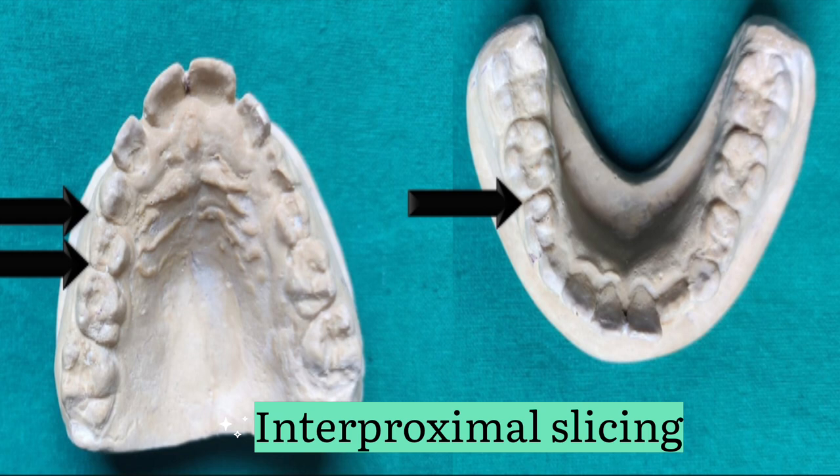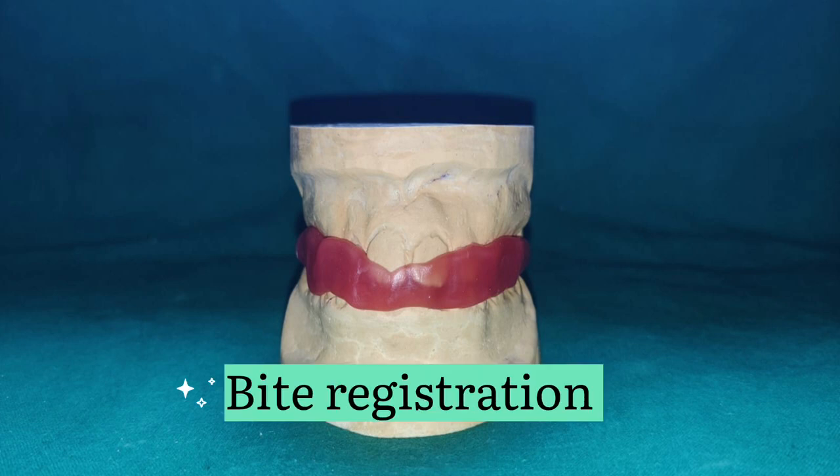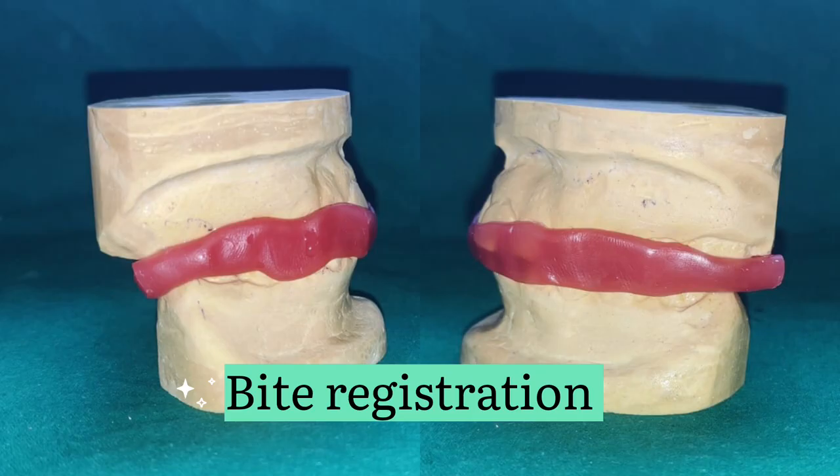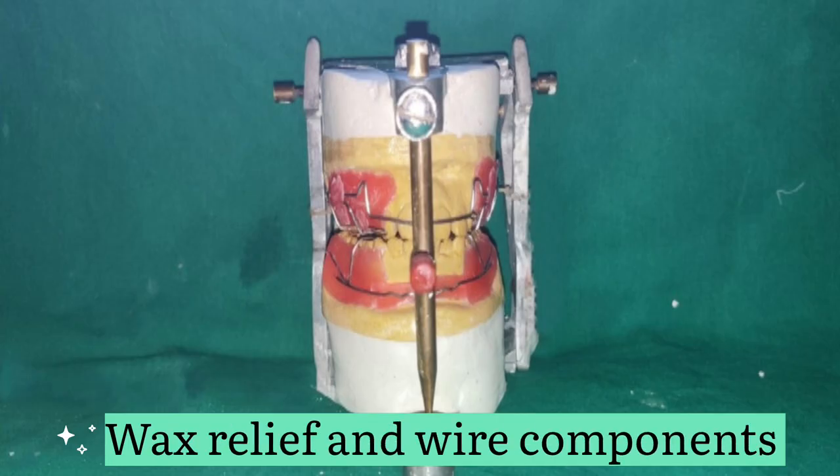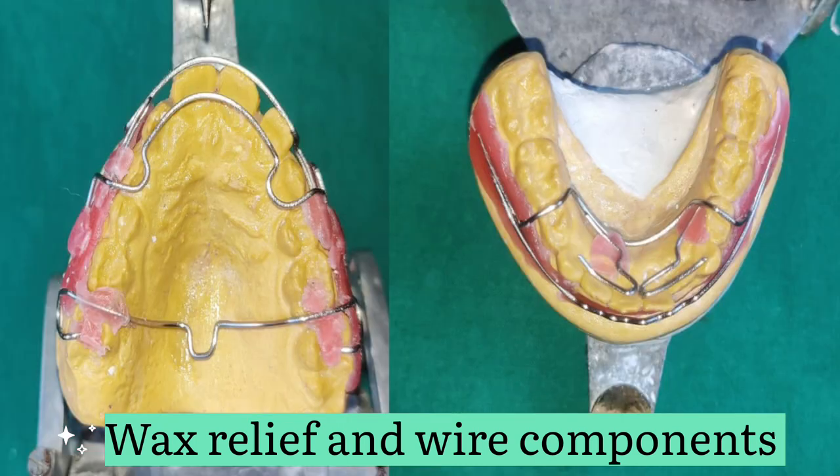After interproximal slicing, the bite registration is done with the help of a wax sheet. In the next step, mounting of the cast is done on the articulator. Once the mounting is done, the cast is relieved with the help of wax, and then the wire components are arranged on the cast. Before moving forward, we will discuss briefly about each wire component.